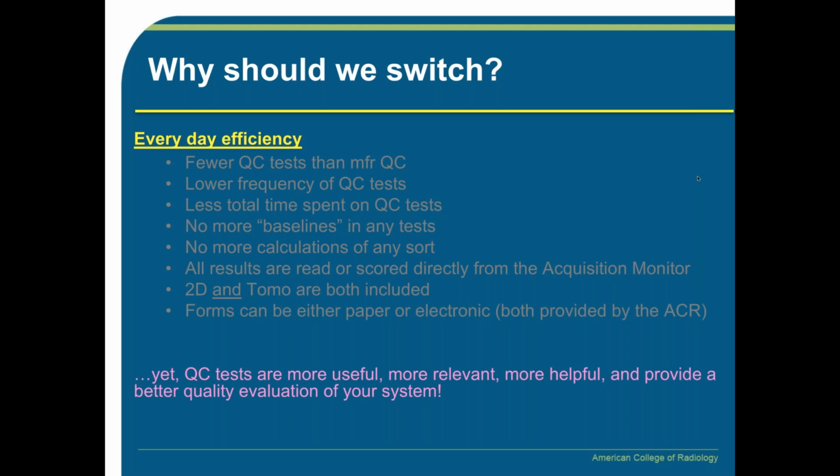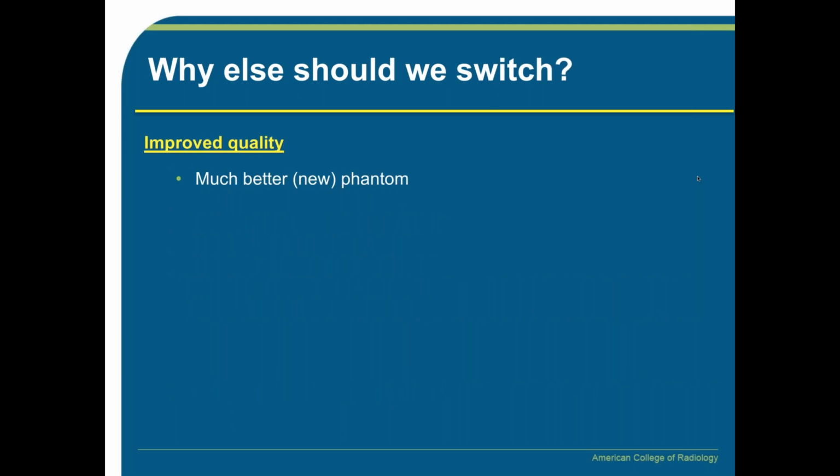And all the while, the ACR QC tests are more useful, more relevant, more helpful, and provide a better quality evaluation of your system. Part of that is because we were able to start from the ground up to develop this program. So why would we say there's better quality? Well, we have designed a much better and new phantom that evaluates artifacts much more efficiently.